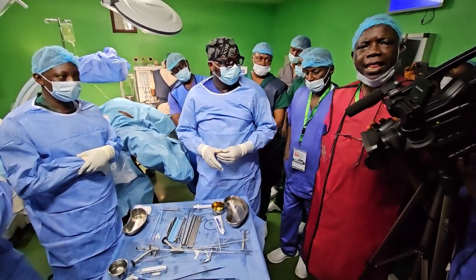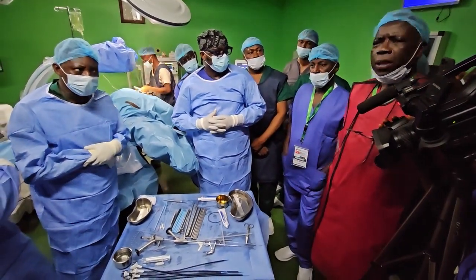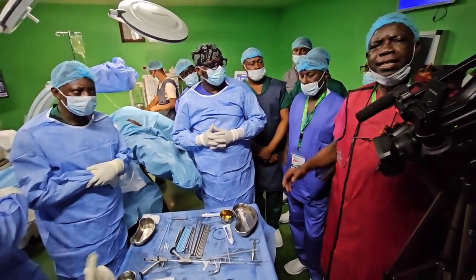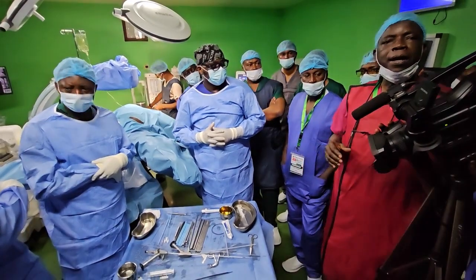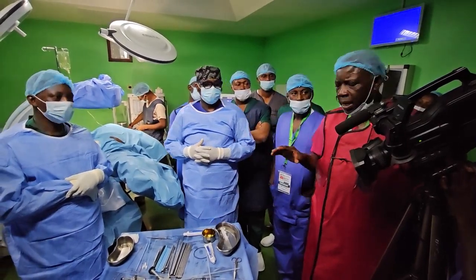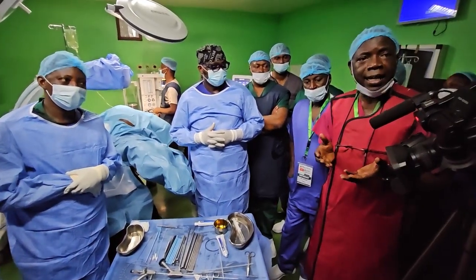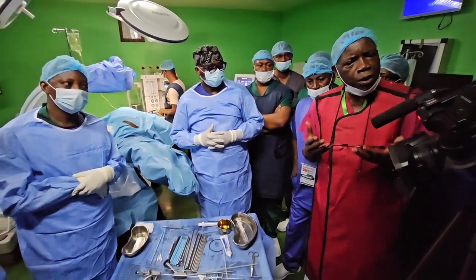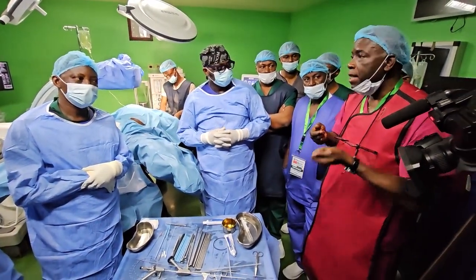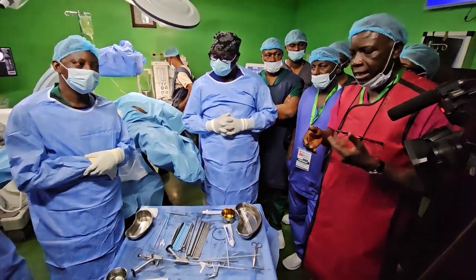All right, but I have to say that this dilator, very few urologists use it now in Europe. Why? Because if you're not very skilled at using it, it can rupture the kidney. I experienced it in Lagoon Hospital in Lagos about 2014. You put it there, and the patient ended up with a partial nephrectomy. Yes, that's one of the complications.